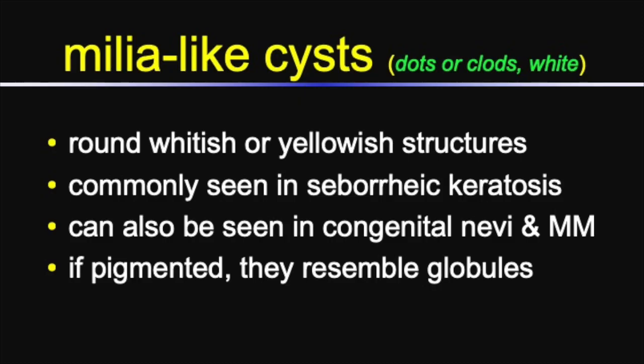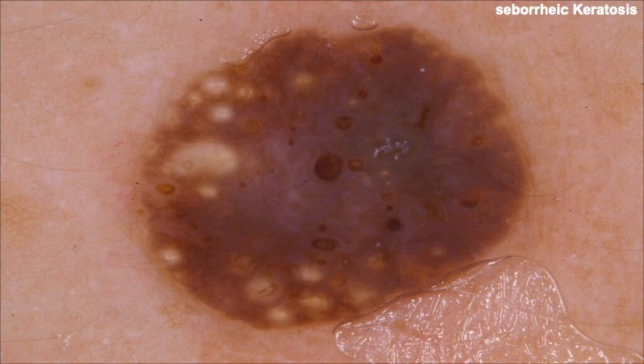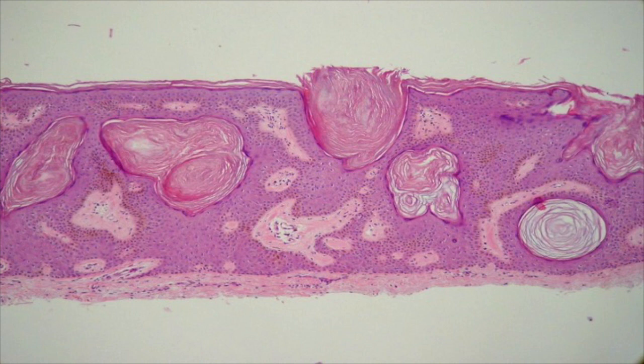Okay, Milia cyst and comedo-like openings, for this audience, we're not going to go through the definition. Suffice to say that they are easily visible even to your naked eye, especially on side lighting. Here are your Milia cysts, here are your comedo-like openings, and if you want to see them histologically, they're your intraepidermal inclusion cysts, and then those cysts eventually will get extruded out to the environment, and they'll open up to the top and become a comedo-like opening, right? So that's your Milia cyst and comedo-like openings.